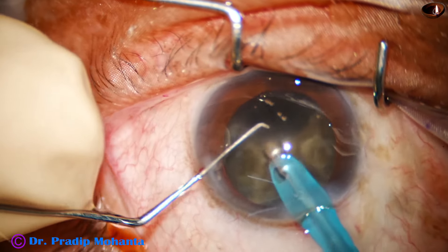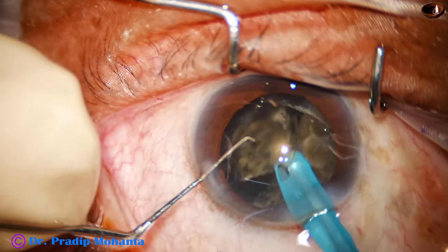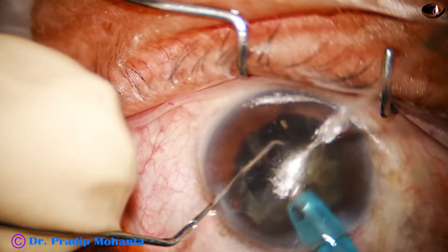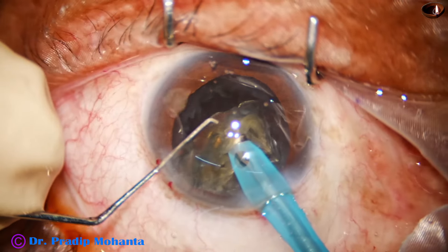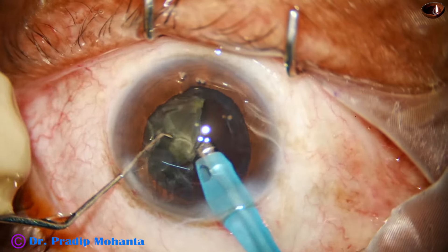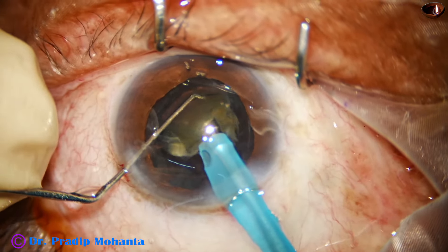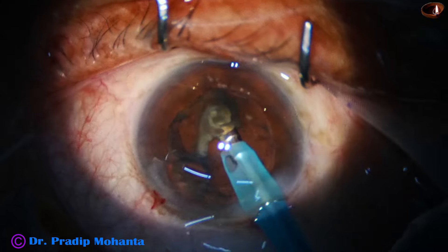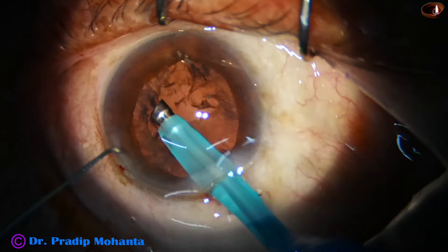The ultrasonic energy from the very beginning is 85%, flow rate is 40, and vacuum is 400 millimeters of mercury. Now the nuclear pieces are being emulsified. We must deliver the ultrasonic energy judiciously — whenever hard nuclear matter is present we deliver a little more energy; when the matter in front is soft epinucleus we deliver very little energy. This energy delivery is controlled by the foot switch, so we have to train our foot to deliver adequate ultrasonic energy.